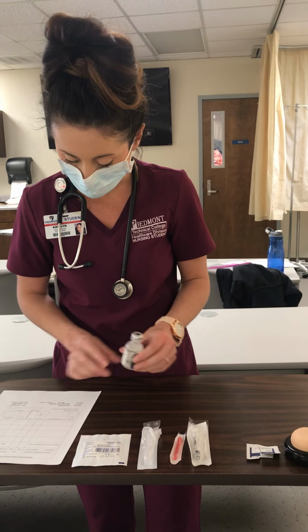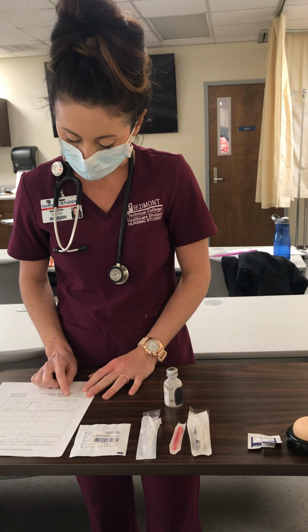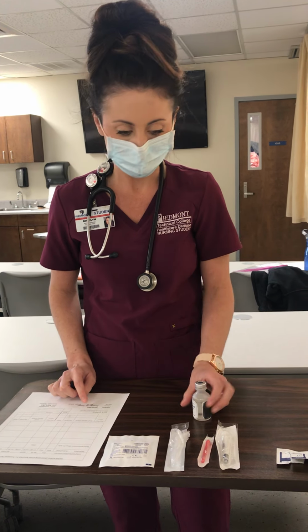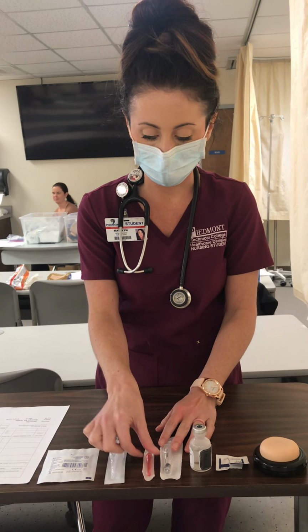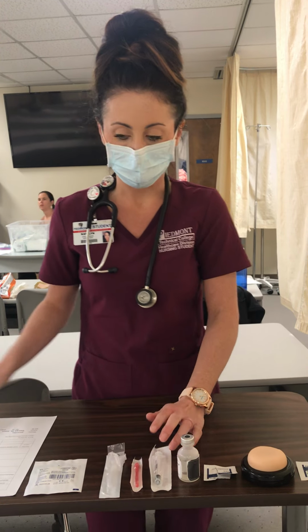Again, it is 8:50 for the patient George Monster Jones, date of birth 10/1XX. He has an allergy to penicillin and there's no contraindications between methylprednisolone and penicillin. I have a 3 ml syringe here and a blunt tip needle to draw up my medication, and I have a 22 gauge 1.5 inch needle to administer my medication.